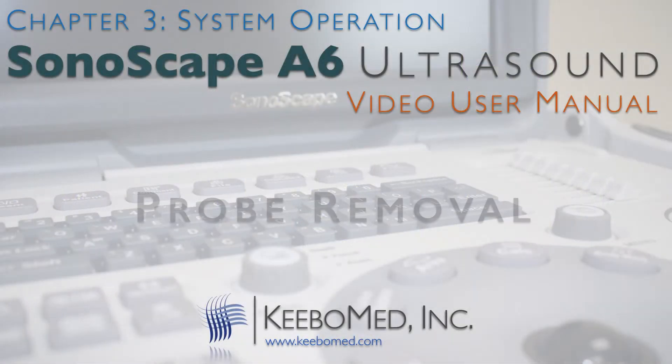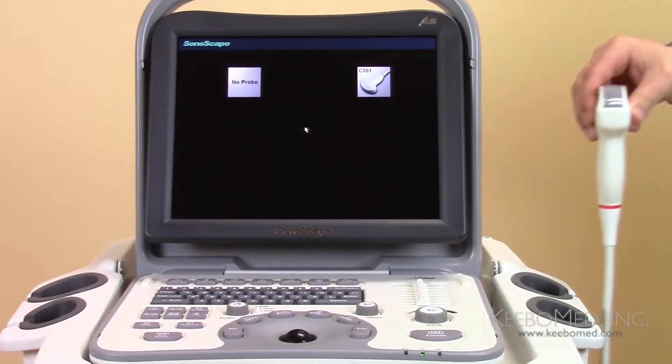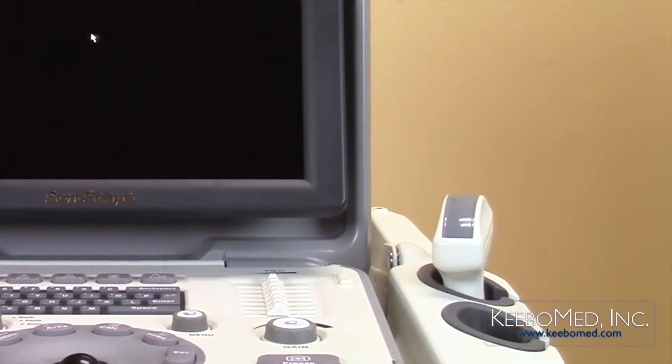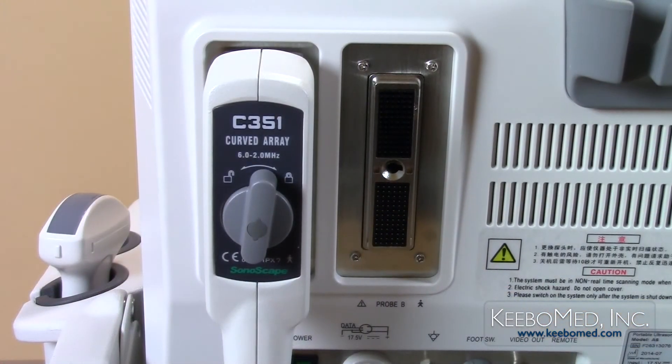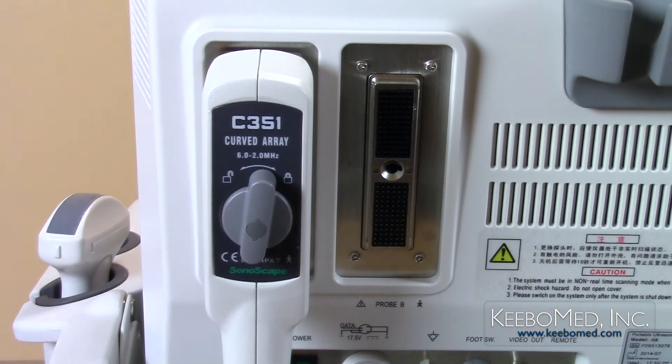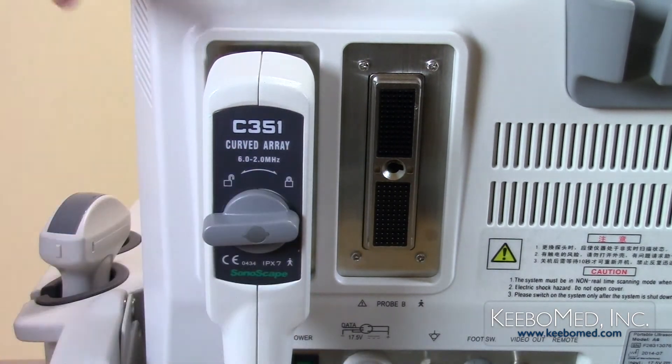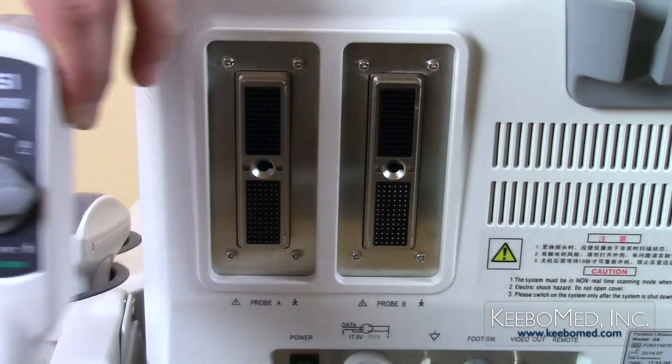To remove the probe, follow these simple steps. Step 1. Put the probe head safely inside the probe holder. Step 2. Turn the lock knob counter-clockwise to the unlocked position and then remove the probe carefully from the probe socket.